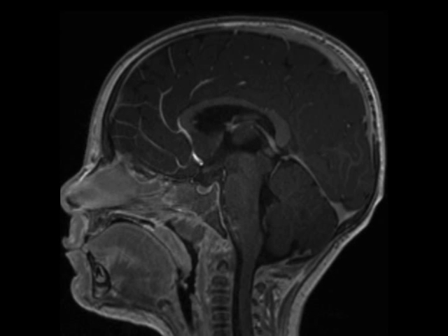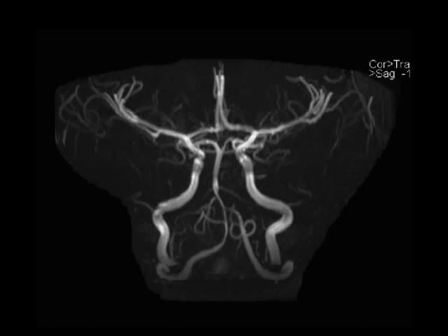The 3D maximal intensity projection reconstructions from the 3D time-of-flight MRA images of the head demonstrate smooth concentric marked narrowing of the distal vertebral arteries, vertebral confluence, and proximal basilar artery. The imaging findings are compatible with vasospasm in the setting of acute subarachnoid hemorrhage.